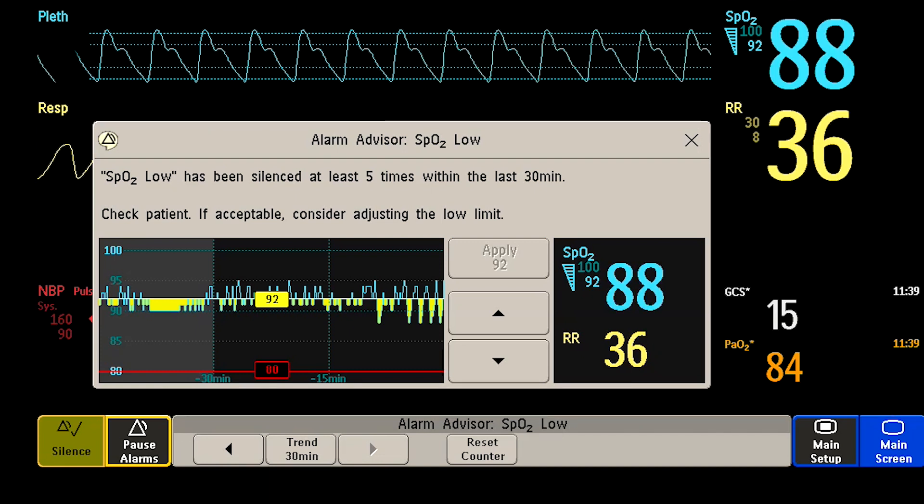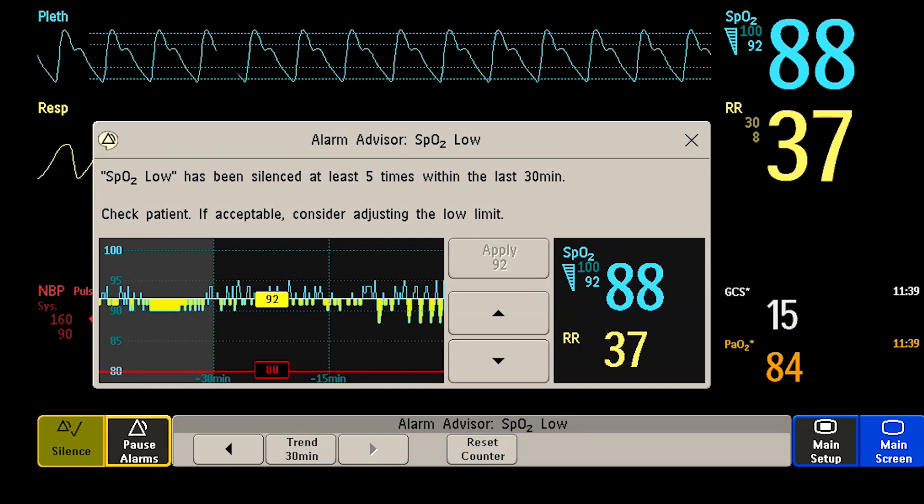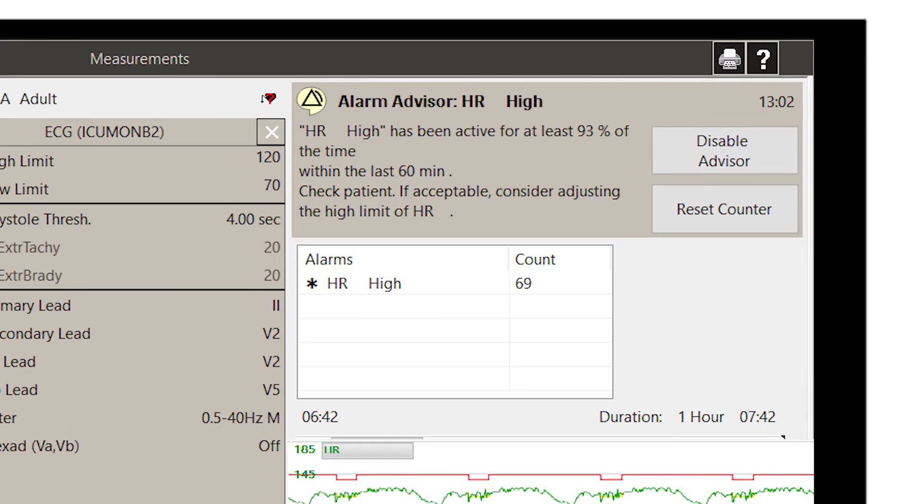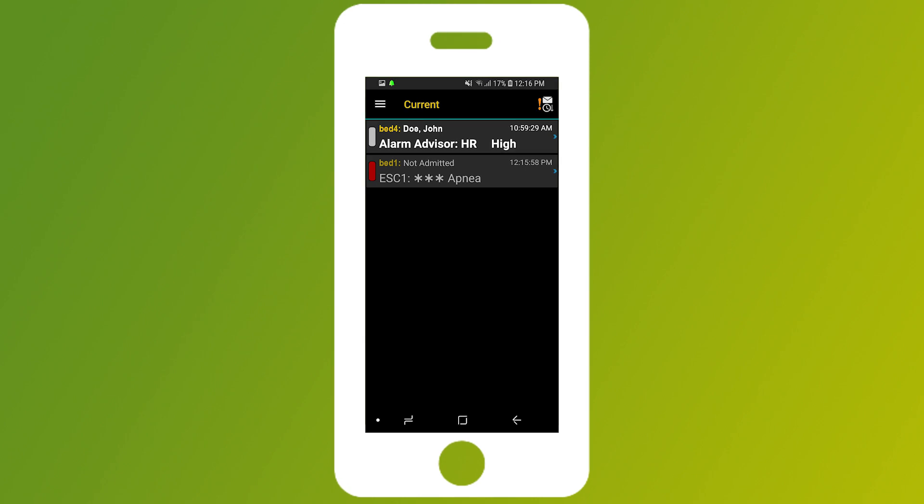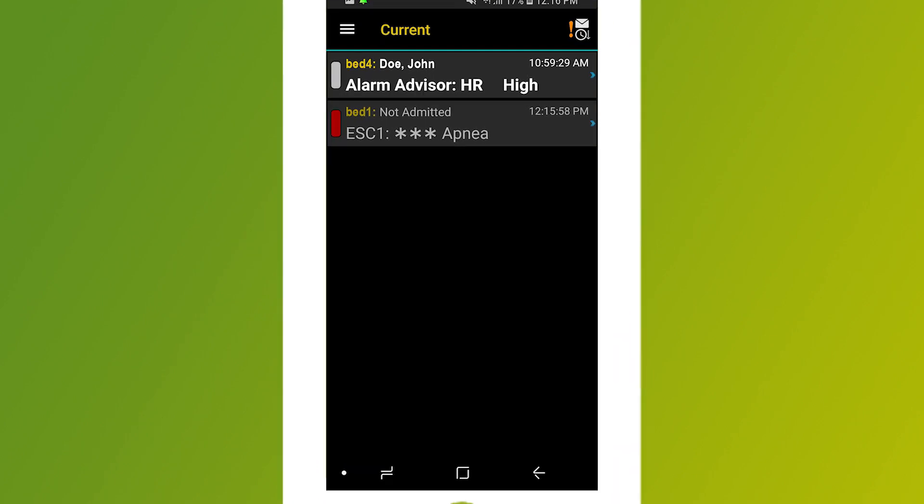At that point, the Alarm Advisor notification icon will be displayed on your patient monitor, your PIC-IX, and even your smartphone.